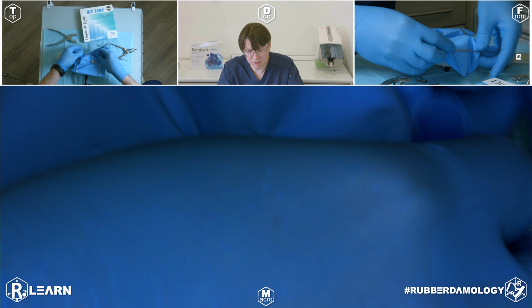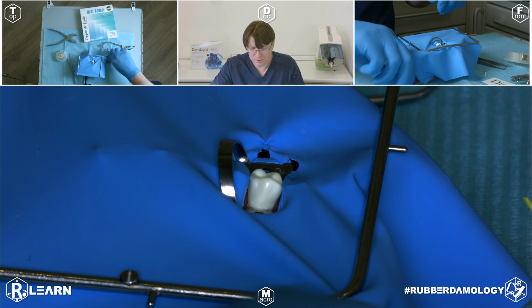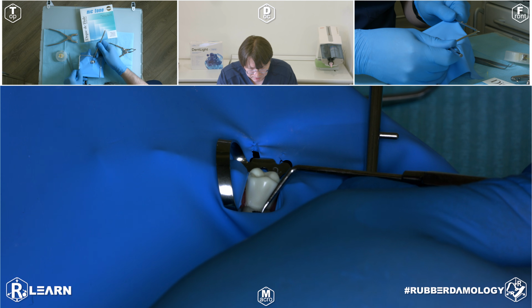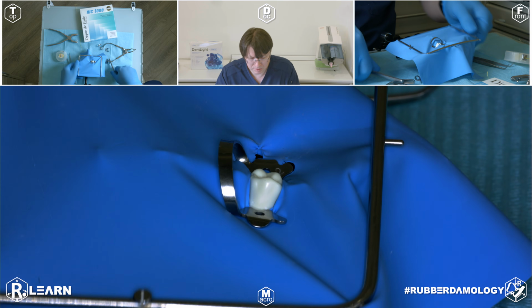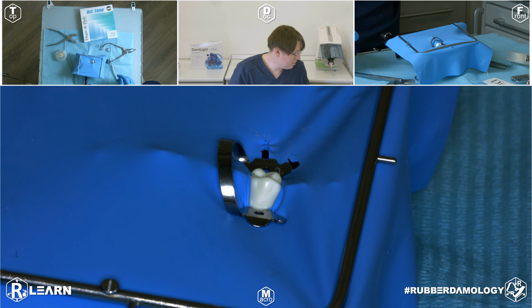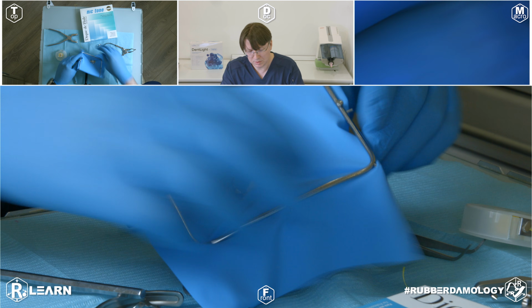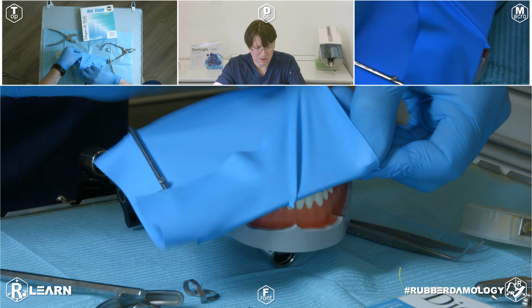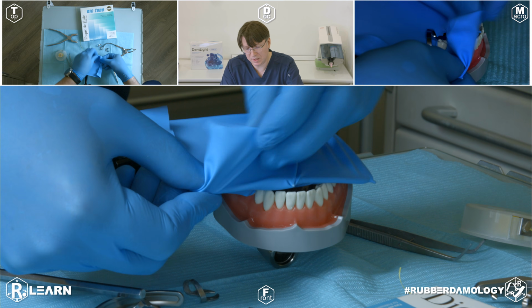Fix your rubber dam. Don't forget to release the rubber dam perforation from the wings of this clamp. Very good. And for finishing our exercises, make an envelope. Our fast isolation for endodontics in tooth number 45 is finished.